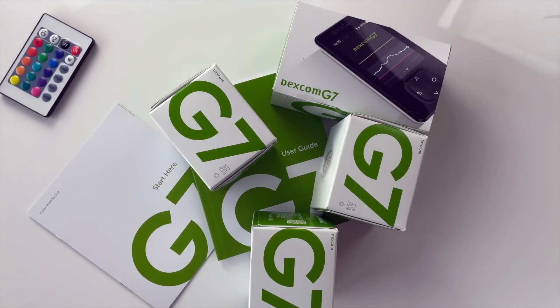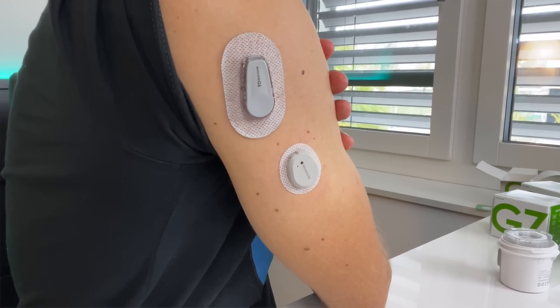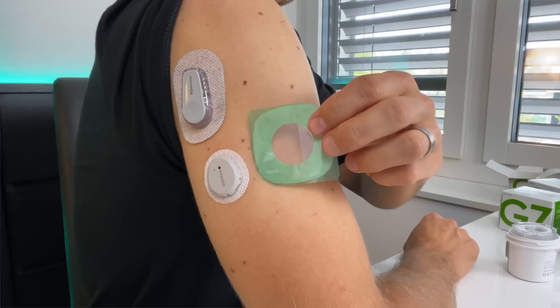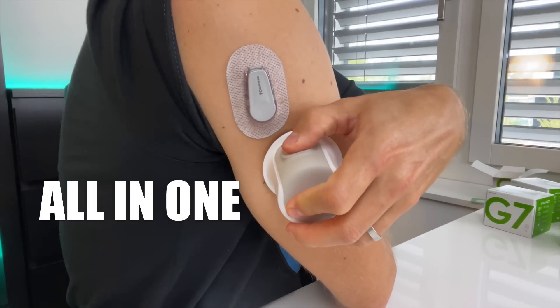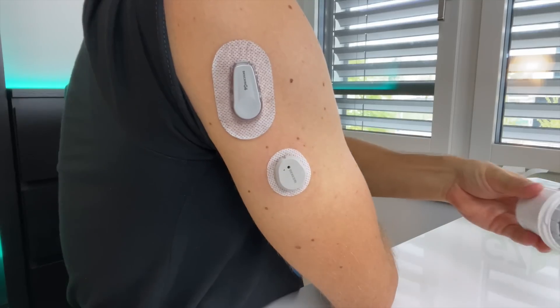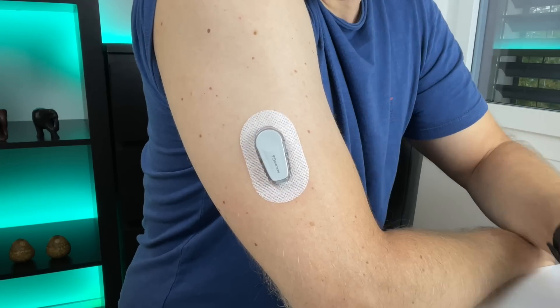Let's look at the wearable first. The G7 packaging, the applicator, and the sensor itself are supposed to be 60% smaller than the previous version, and they really are a lot smaller. They also have a bright green overpatch in the package, which is nice especially if you're a fan of Dexcom's brand color. The G7 has an all-in-one mechanism — both the sensor and transmitter are applied at the same time, just like with Freestyle Libre, with no separate transmitter or applicator like the G6.